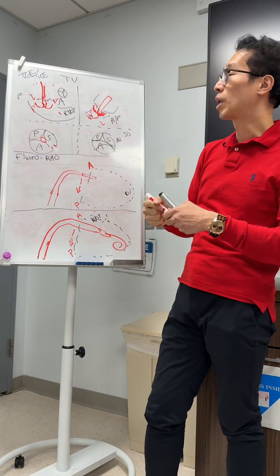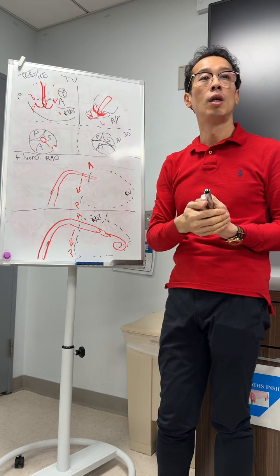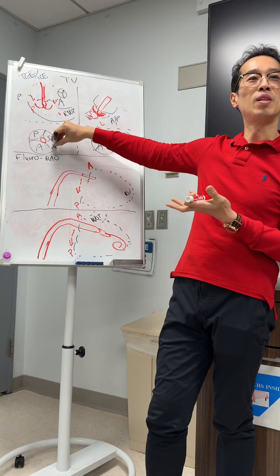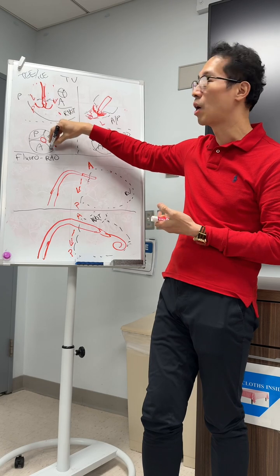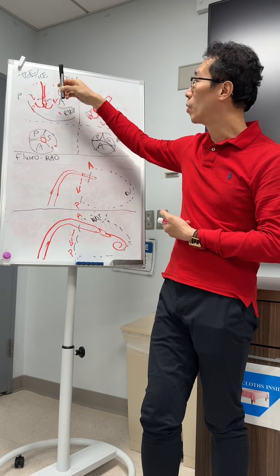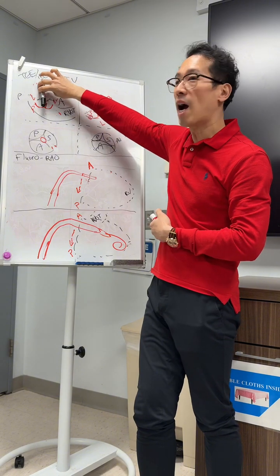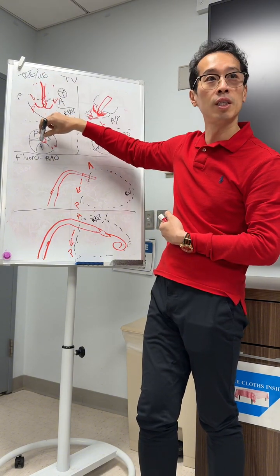Going back to the MPR, suppose I MPR the device. The device, let's say, is here. It looks good, right? You have the device reference, but you're totally offside. So if you're here and you retract, you should see on this transgastric that this is going towards the center.